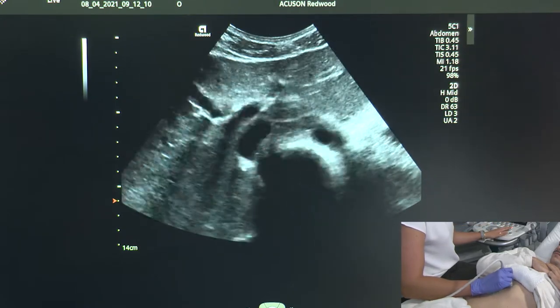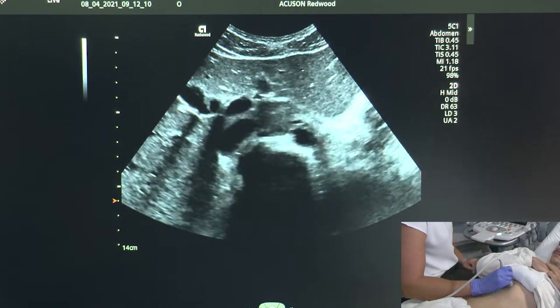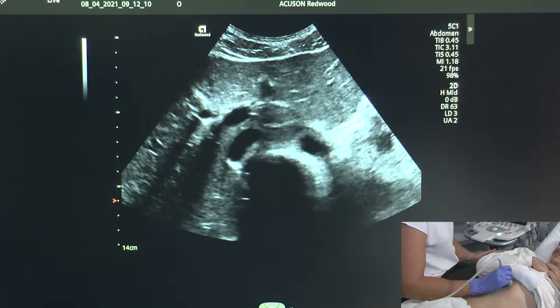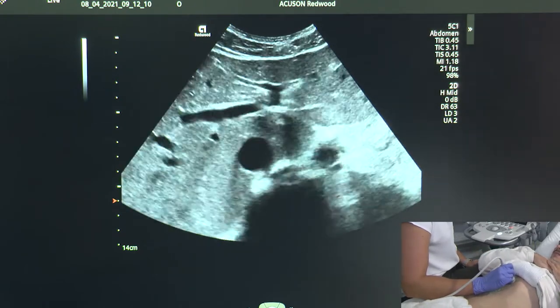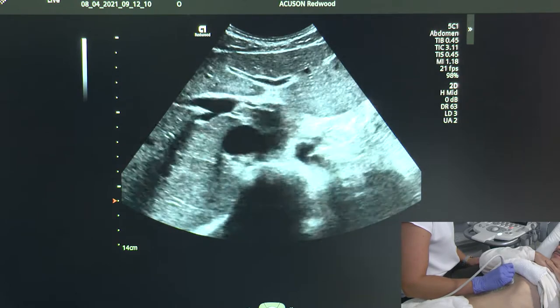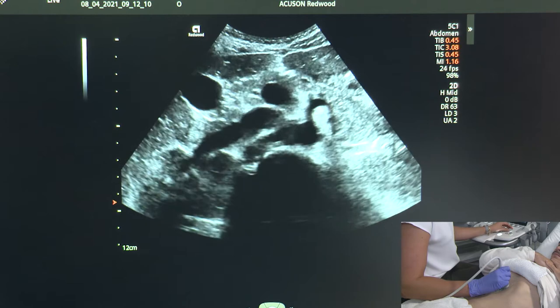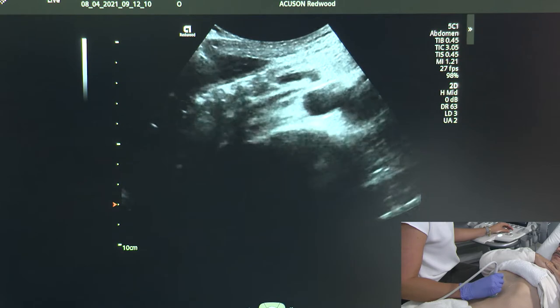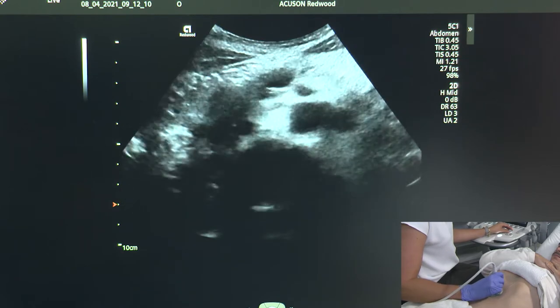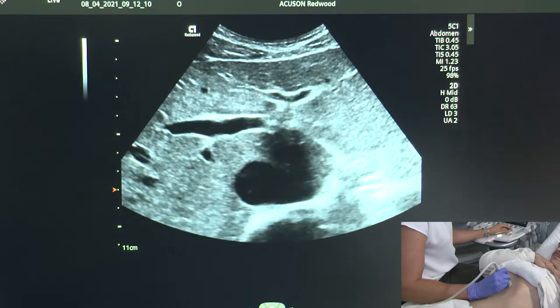I'm going to break up my interrogation in the transverse plane so that I'm only interrogating the head. Take a big breath in and hold it. I'm only going to be looking at the pancreatic head — I'll sweep all the way through that tissue, come all the way back up, and let my patient breathe.